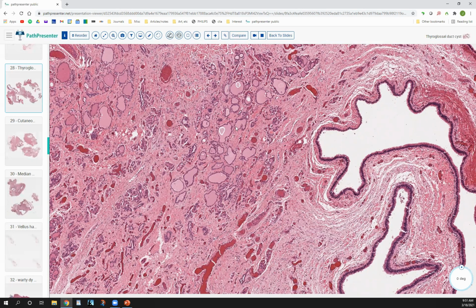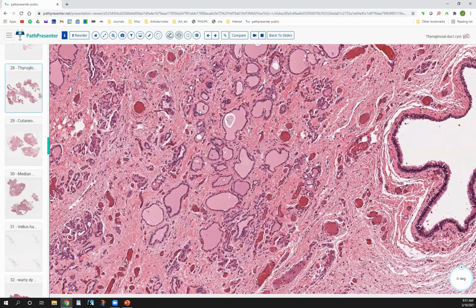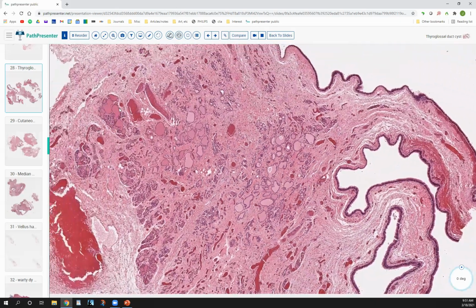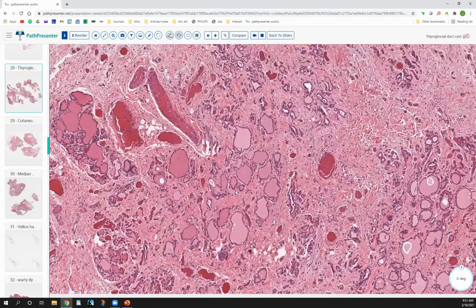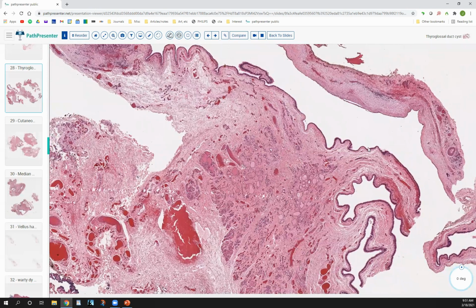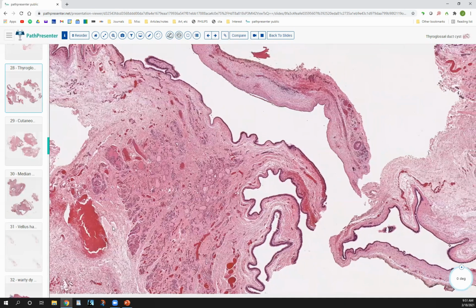And this is really what you need to see for this. If you haven't seen too much thyroid, it's fairly distinctive. You have these little thyroid glands with this eosinophilic material, and it's very easy to recognize once you've seen one or two of these. So as long as you have those in the wall, the rest of this looks very similar to bronchogenic cysts. So use anatomic location and use what's in the wall to distinguish the two.